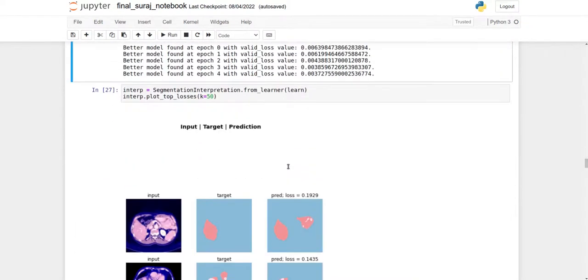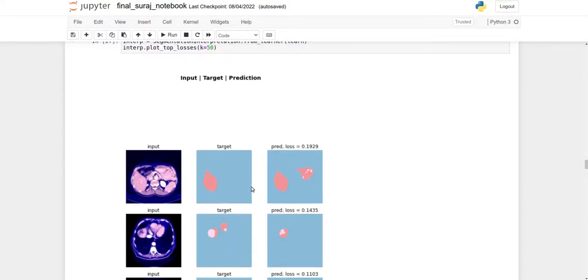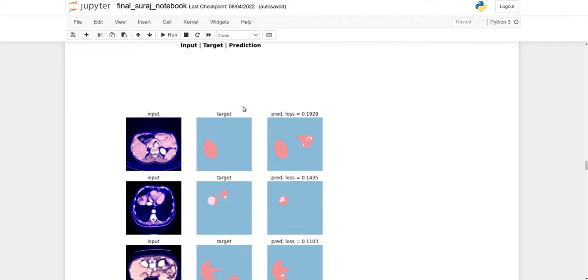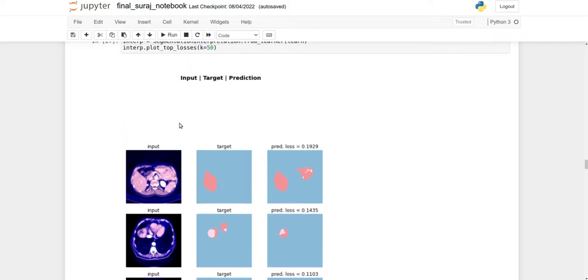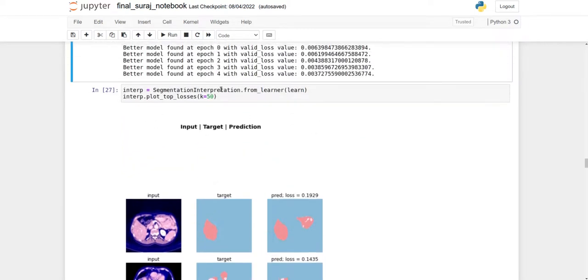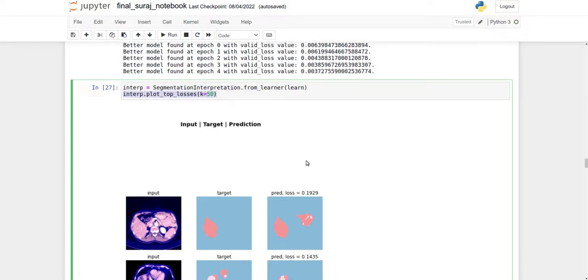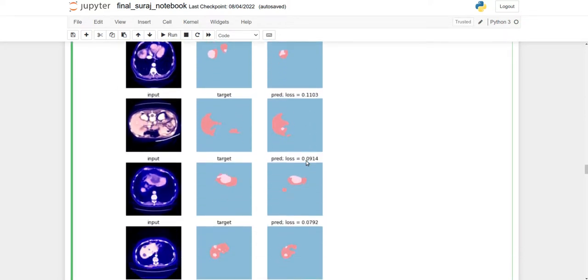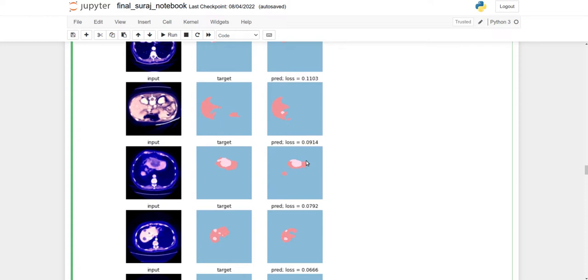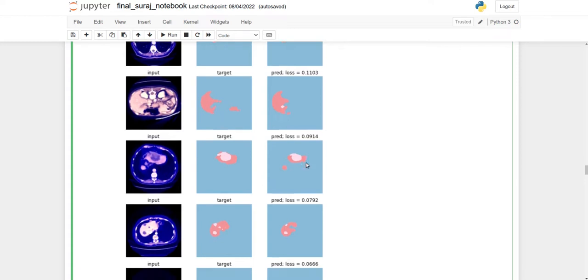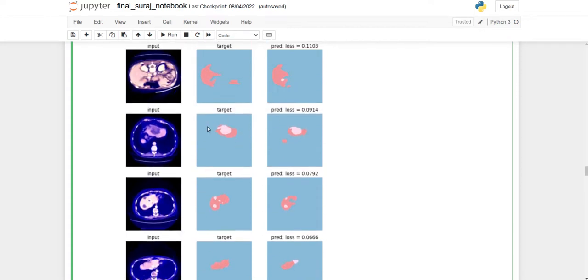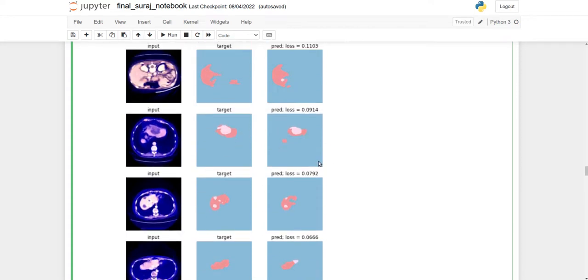After training, your pre-segmented image looks like this where the liver is targeted. Here's the input image, the target original image, and the predicted result. This is available in FastAI segmentation interpretation from the learner, plotting the top 50 losses. The results are pretty good, and the liver is located successfully.